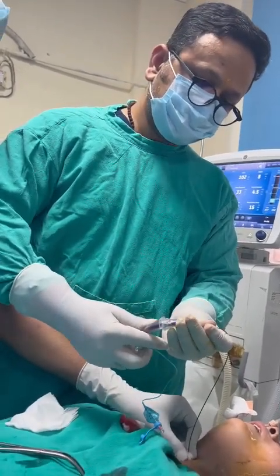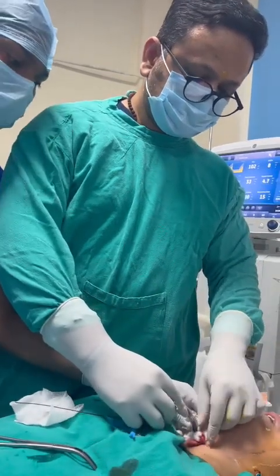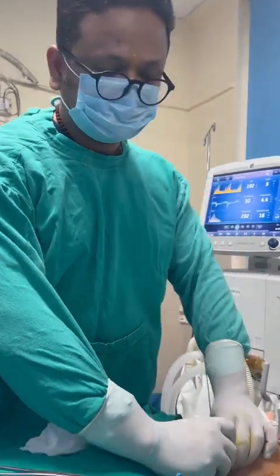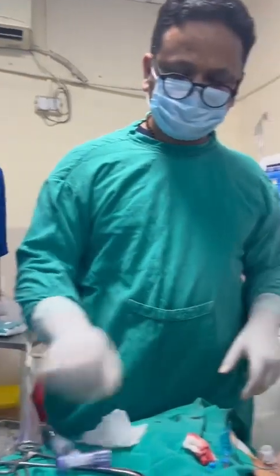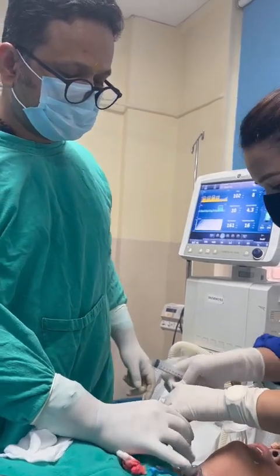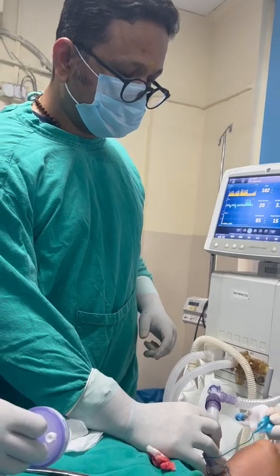Actually, with a short neck, the problem is that your patient has such a small space to operate. That's why it becomes tricky. So, catheter mount. Better disconnect this catheter mount. Inflate this tube. Inflate this one. No problem.